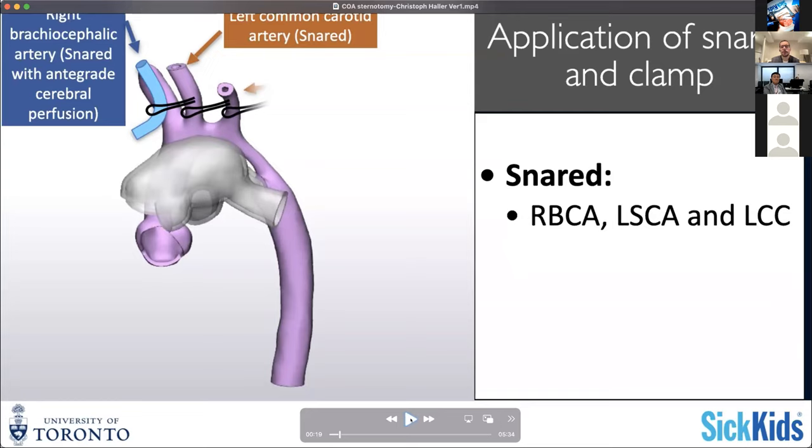The way I've been taught is to use basically a direct open cannulation of the innominate artery with a little cannula to perfuse the brain for selective cerebral perfusion. But I've recently been taught by David how to start with basically anastomosing a shunt to the innominate artery, which is very convenient as well.